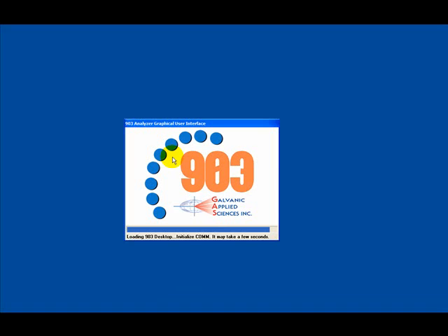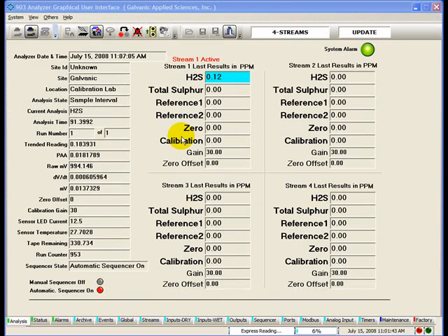Start the 903 Analyzer software. The GUI is a Windows-based point-and-click interface. When the software is first opened, the analysis screen is the first page you see.